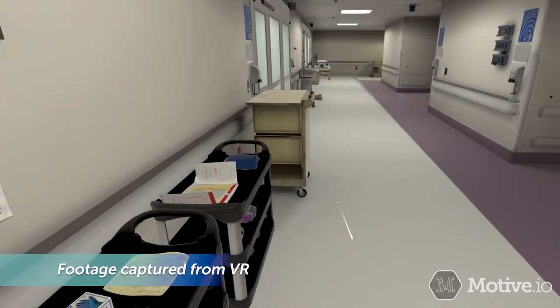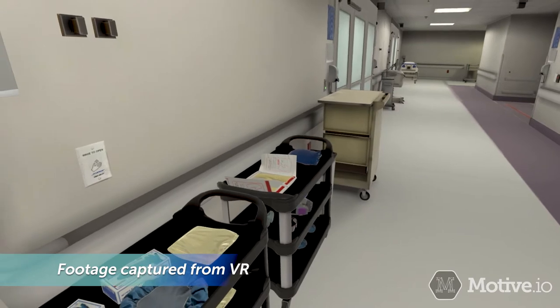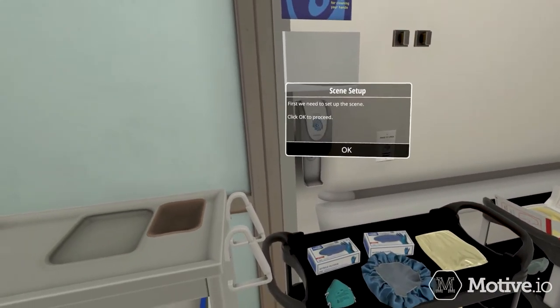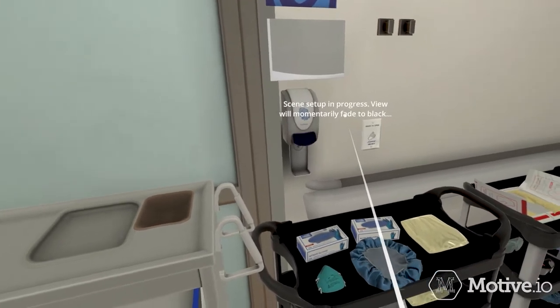Airborne precaution PPE must be donned when you will be involved in aerosol generating medical procedures such as intubation. First, we need to set up the scene. Click OK to proceed.